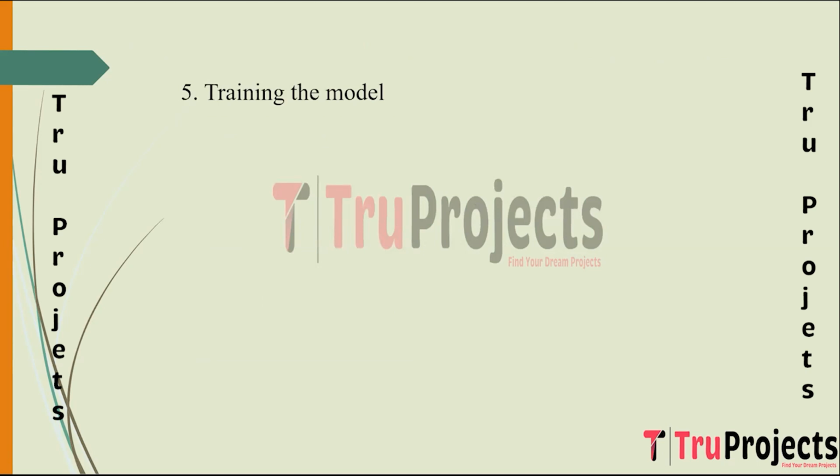Training the model. This phase involves feeding the pre-processed dataset into the hybrid convolutional neural network (CNN) model. The model learns from the data through an iterative process of forward and backward propagation, adjusting its weights and biases to minimize the defined loss function. During training, the model aims to optimize its parameters to accurately classify different stages of diabetic retinopathy using the labeled fundus images. Metrics such as accuracy, loss, precision, and recall are used to evaluate the model's performance and guide adjustments in training strategies or model architecture.